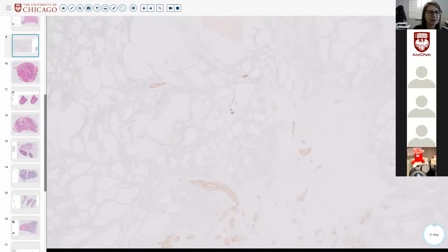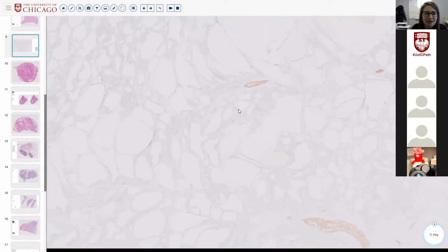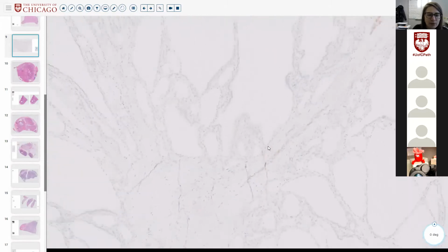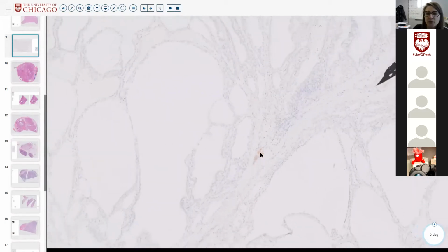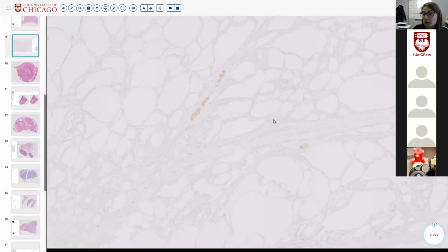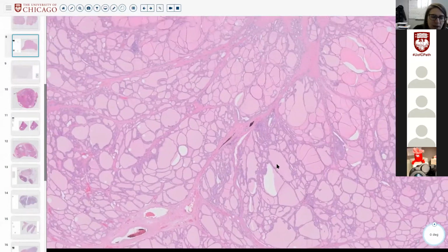This is great. Look how far this tumor spreads. It's sending tendrils right out into the normal thyroid. It's sending foci up here and out here. When BRAF works, and it works well, boy, is it striking, because it will highlight every single tumor cell, and you can see how far this thing stretches, which maybe is farther than you initially thought. So number one, it confirms the diagnosis, and number two, it confirms the stretching of it. And so now let's go back.